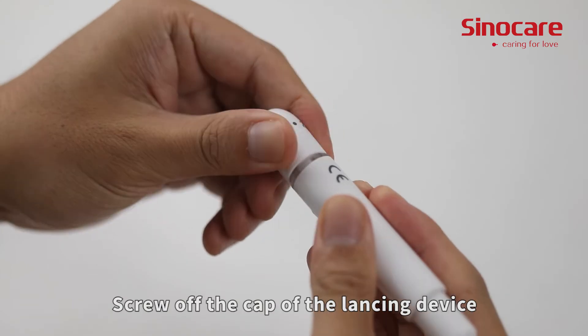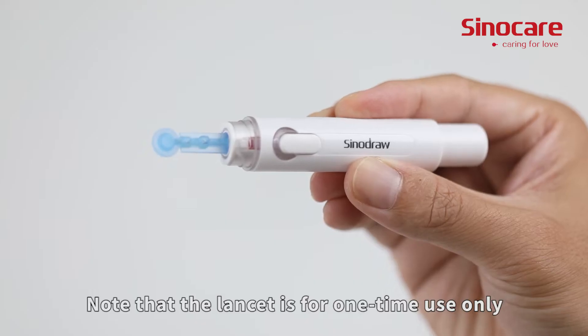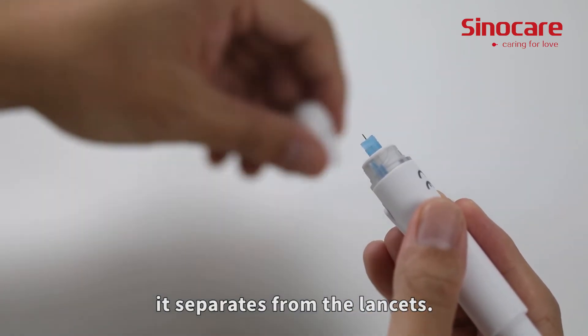Screw off the cap of the lancing device. Insert the lancet into the lancet holder and push down until it is fully seated. Note that the lancet is for one-time use only.